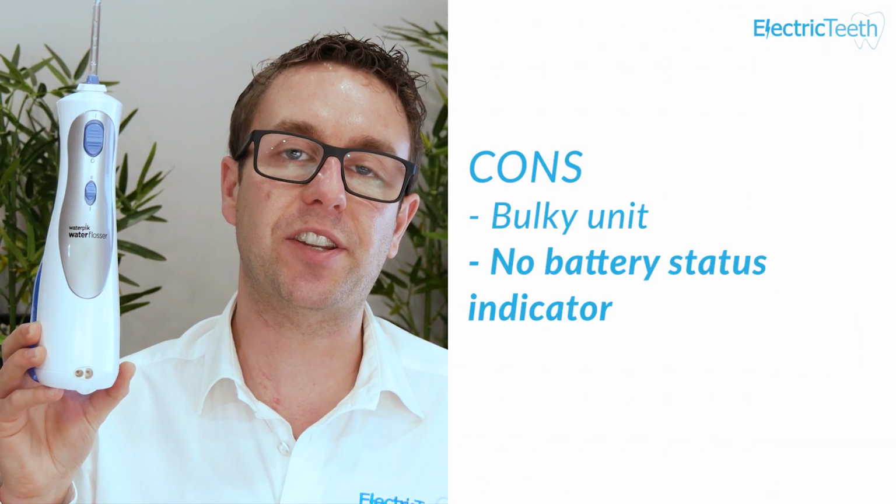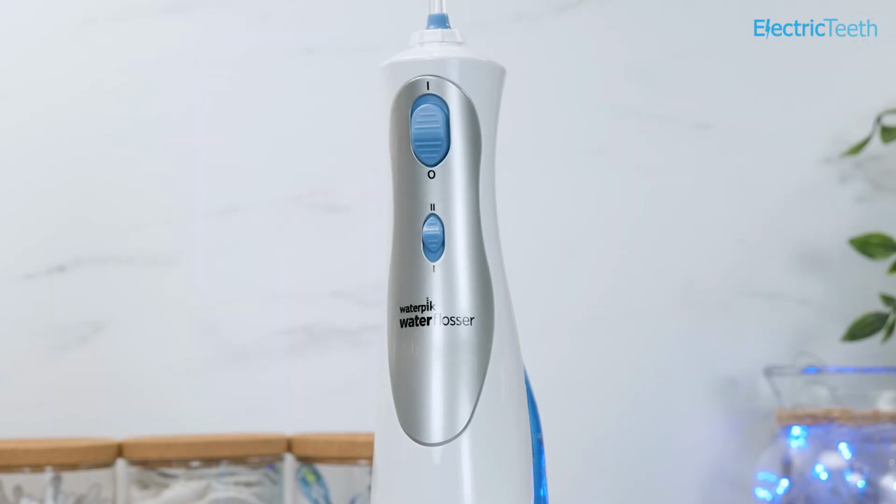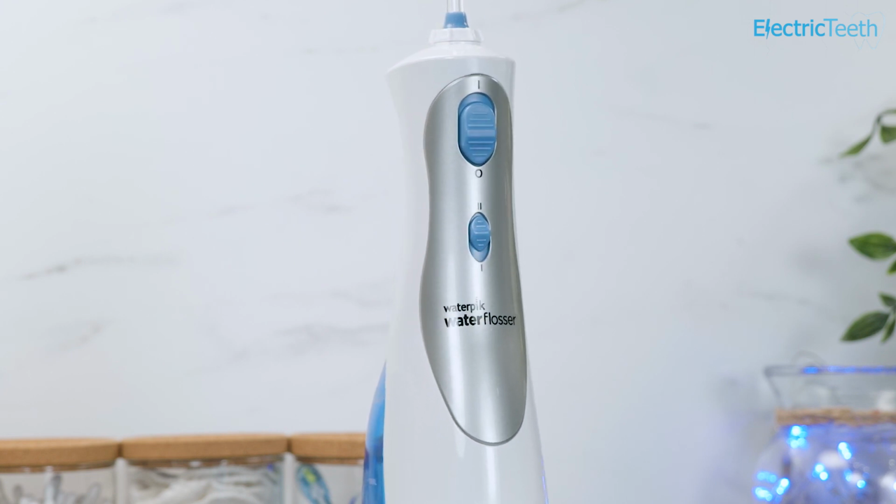So another con has to be the lack of a battery status indicator. Most electronic products, including electric toothbrushes and cordless water flossers, have some form of LED on the front of the unit to indicate that the battery is either on charge, charging, or it's losing power, in need of a charge. On this Cordless Plus, you've got absolutely nothing to give you any indication as to how much battery power remains in the built-in battery. So the only time you know this is actually running low is when it physically stops and no longer powers because the battery has run out.